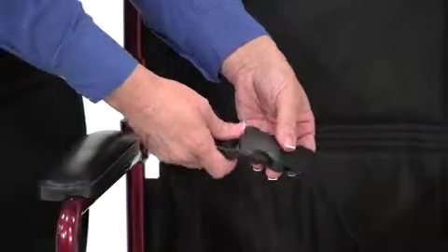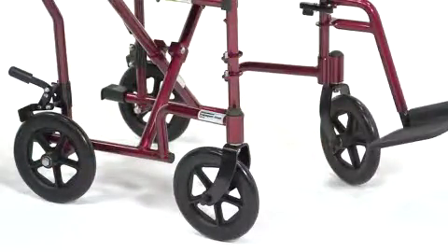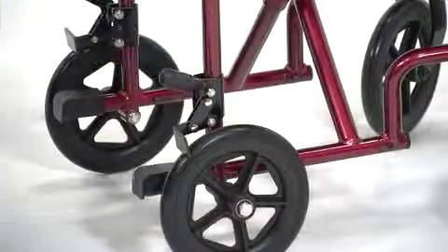The transport chair has a nylon seat that is breathable and easy to clean, and the built-in seat belt enhances passenger safety, as do the solid 8-inch wheels that also make for a smooth, stable ride over most surfaces. When at rest, these rear wheel locks secure the chair.